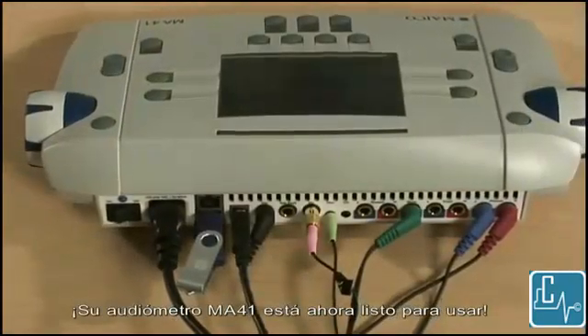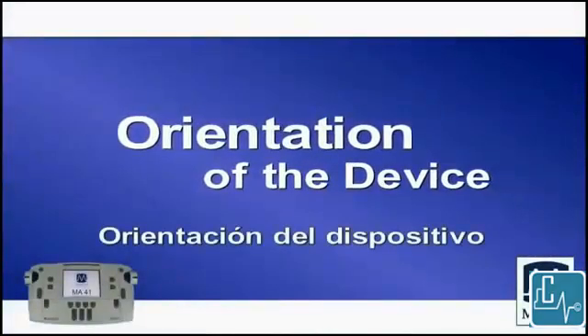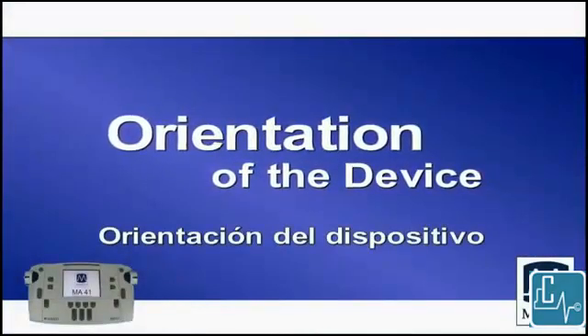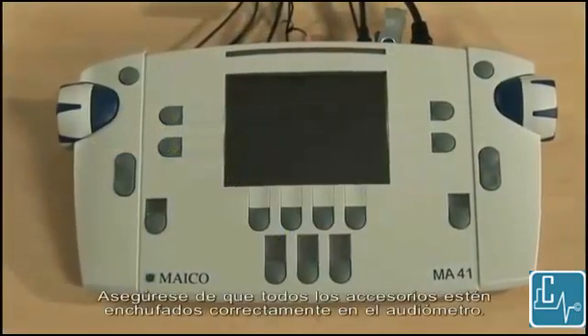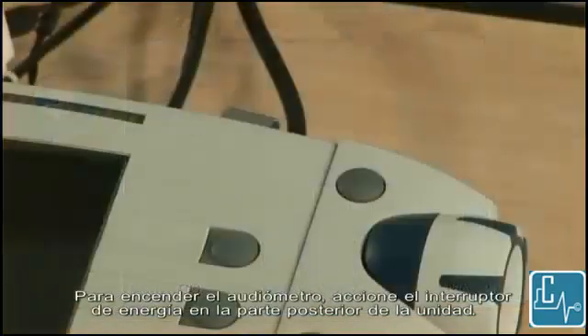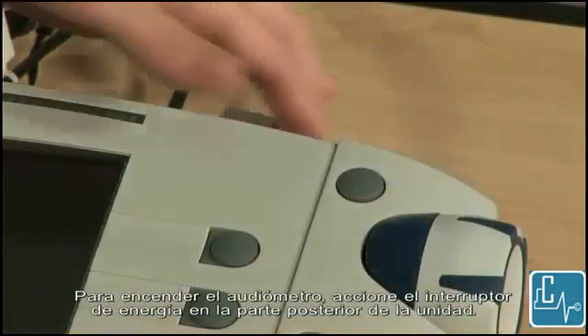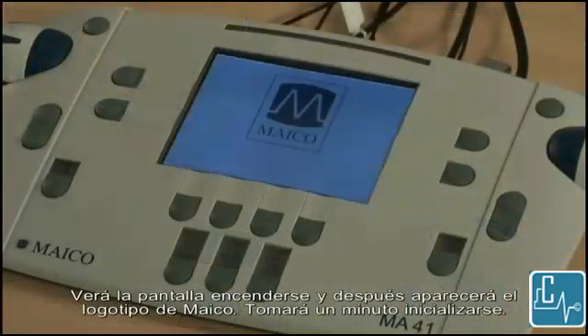Your MA41 audiometer is now ready to use. Make sure all of the accessories are properly plugged into the audiometer. To turn on the audiometer, flip the power switch on the back of the unit. You will see the screen display light up and then the Maico logo appear. It will take a minute to boot up.